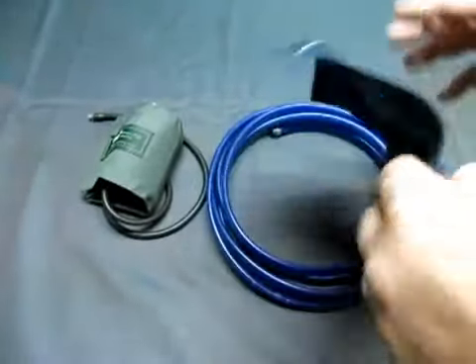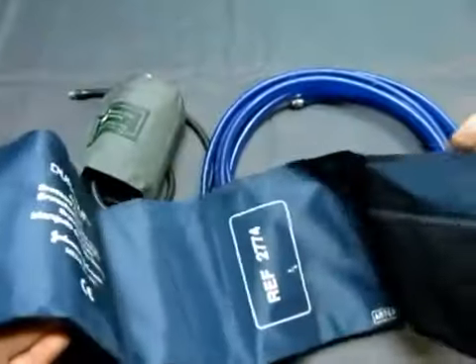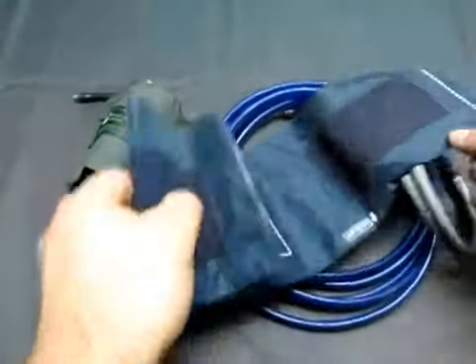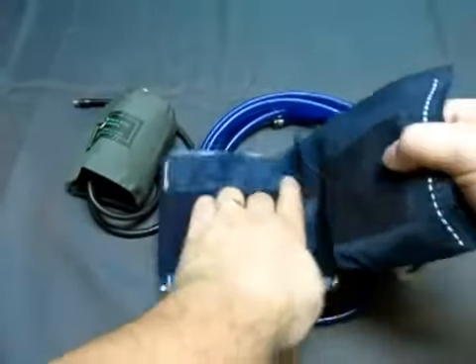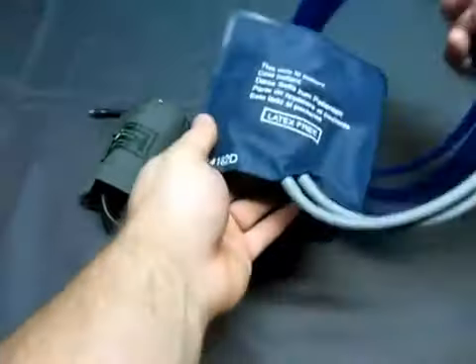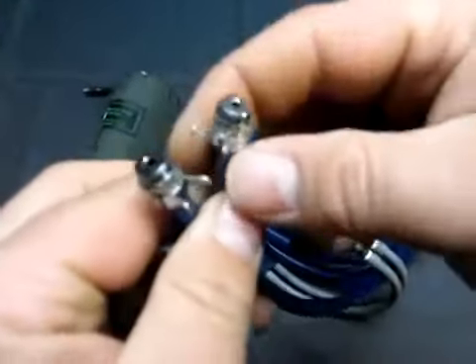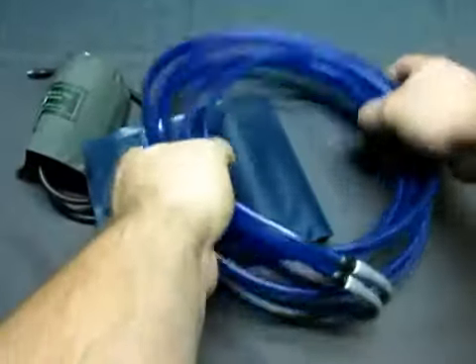This one here is a Dura-Cuff adult cuff, and the size is 23-33cm. It also has the cable to connect to the machine, and this is what they look like — you get the hose with it.